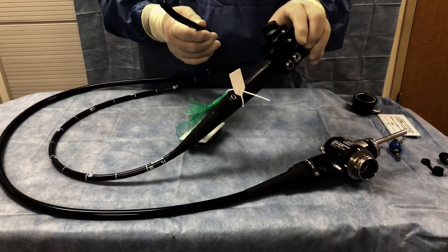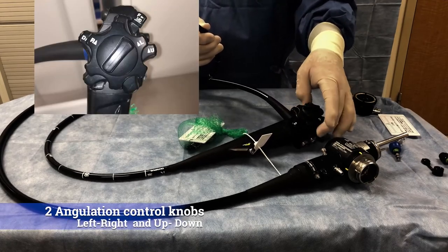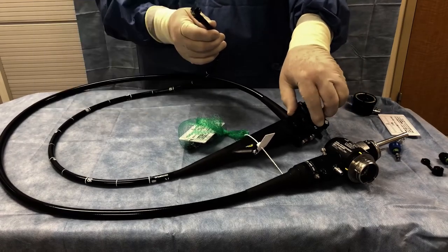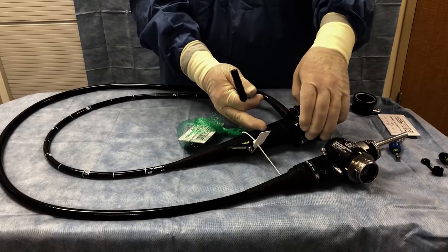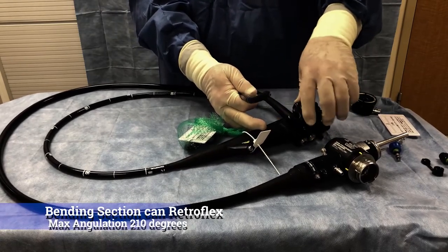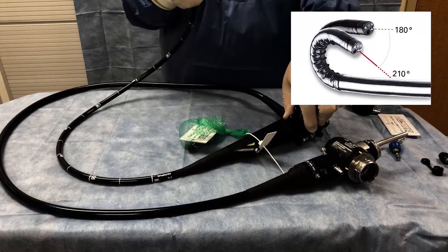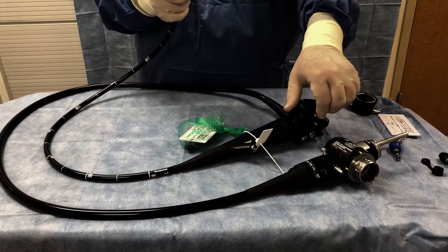Down here you will see these two knobs. One is for left and right, and the other one is for up and down. If we want to, we can make this scope turn around and look back down on itself, kind of like a candy cane, so we can look and see behind us while we are in there.